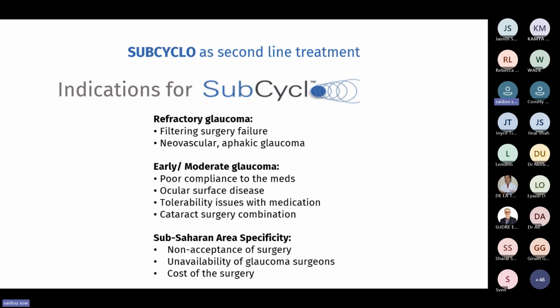Some particularities in sub-Saharan areas. In case of non-acceptance of surgery, we can propose this technique to our patients. In case of non-availability of a glaucoma surgeon, because here in Senegal, in some regions we don't have a glaucoma surgeon, it can be a very good alternative to propose Subcyclo. Sometimes it can also be due to the cost of the surgery.